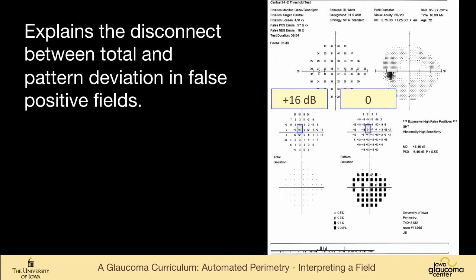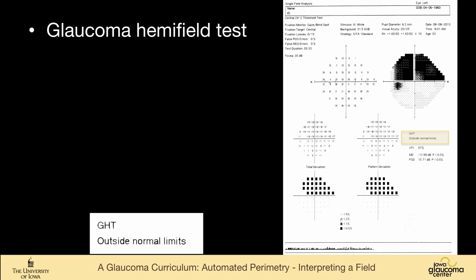And this explains that disconnect that we see in false positives because now the seventh most sensitive point set at zero is actually 16 decibels above normal for age. So anything that doesn't make that ridiculously high cut is considered to be depressed for pattern deviation. And again, you see this white area here that should always make you think of false positivity, 57% false positives, and this disconnect, normal total deviation, abnormal pattern deviation.